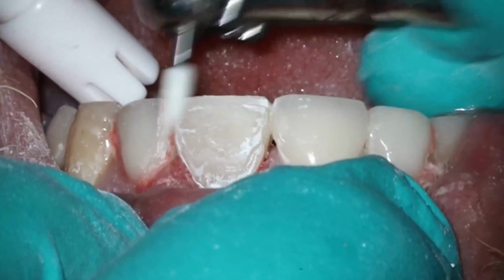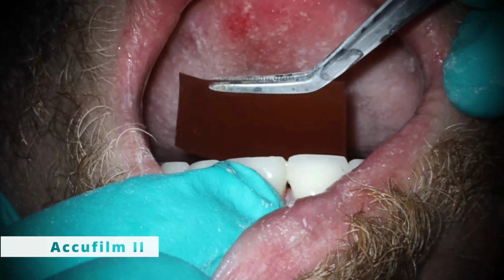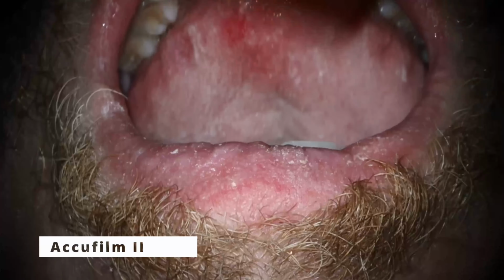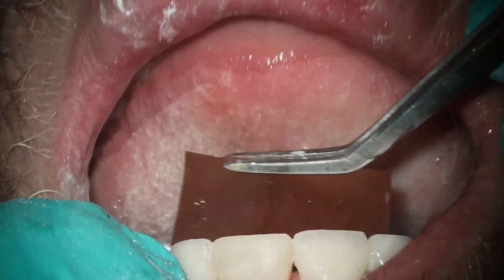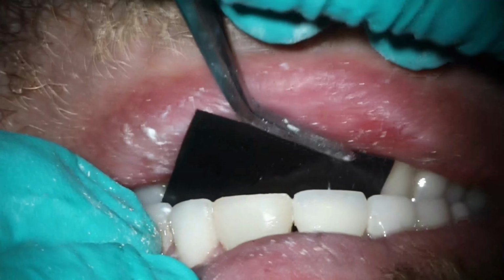So after we finish up the polishing, we do need to talk about the bite, because anterior teeth are a little bit different in that you have to check all sorts of things. So this is your centric bite right there, and definitely a little bit high right away. I don't have them do any excursives until I get the central bite stable, because if it's high there and you start putting force on it, you can break the tooth. So that's what you're seeing me do there.